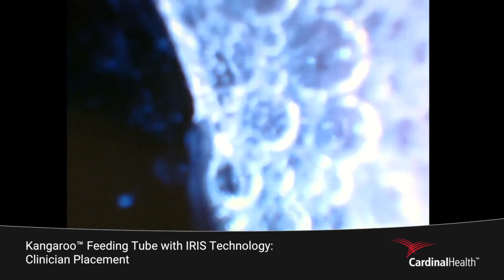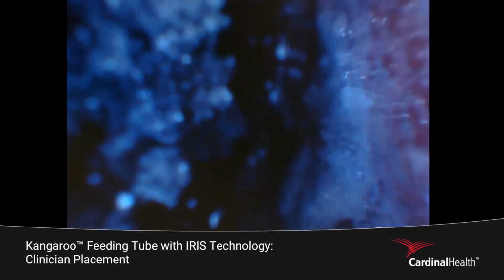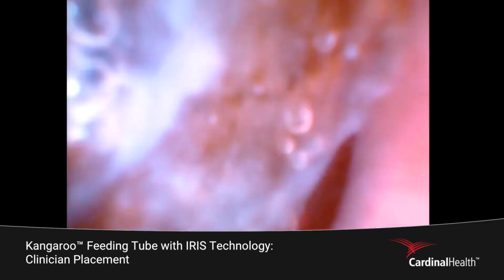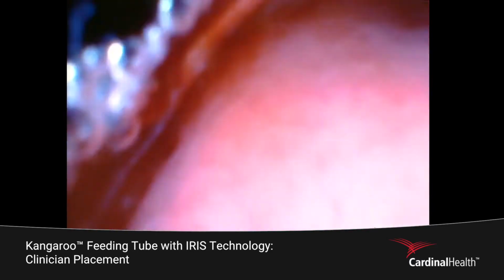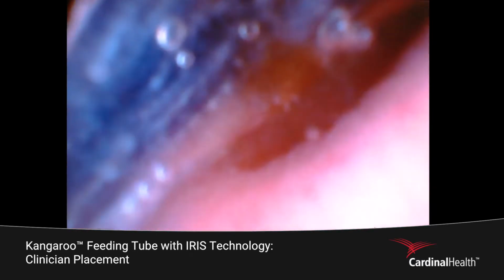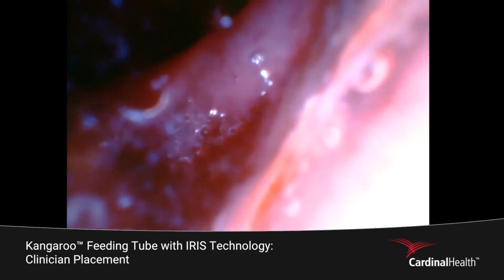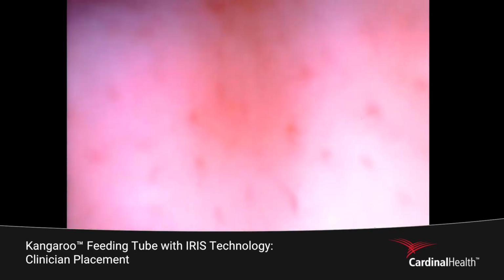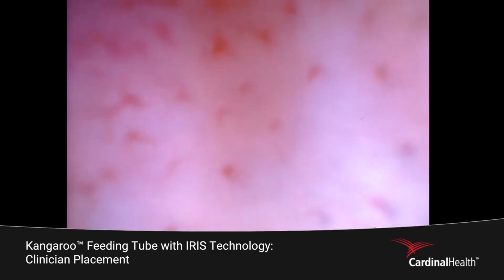Okay, getting close right now. Okay, just entering into stomach. So good, so right now on the screen, really good views of the rugae and the folds of your stomach. And I'm just walking it down towards the base, the bottom of your stomach, walking it towards where your small intestine empties from your stomach.